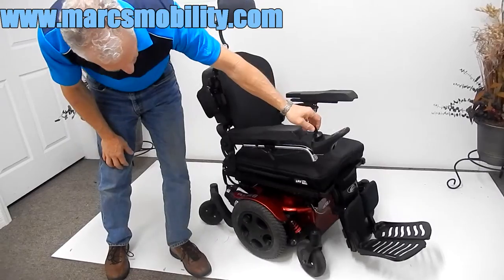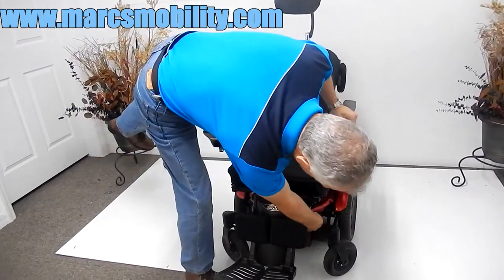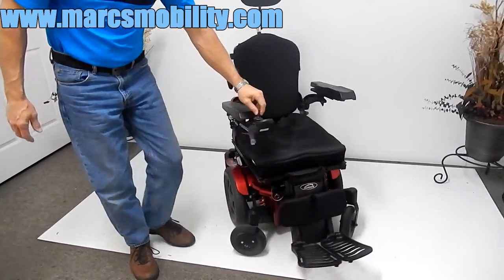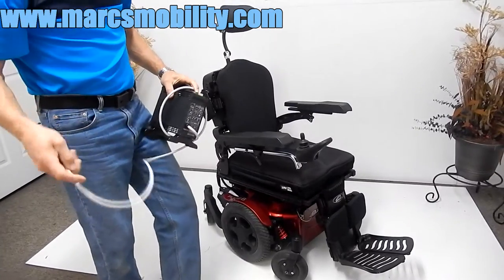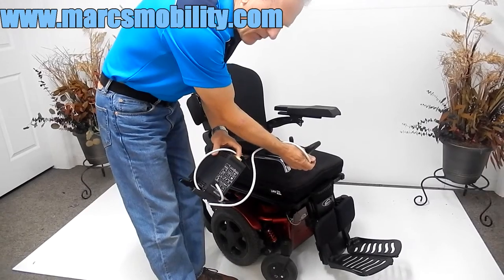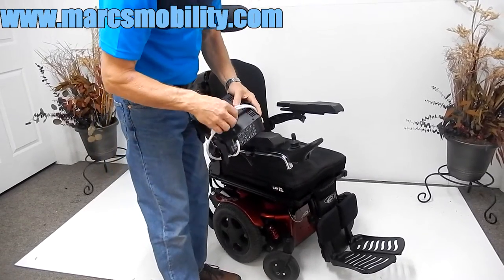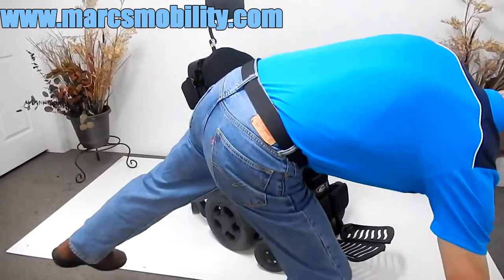The batteries in this chair come out from the front — you would have to tilt the seat up, pull the pins off the front, and slide the batteries in from the front. When you charge this chair, take your charger, plug it into the wall, and put the connector into the bottom of your joystick. When the light on your charger turns green, you're fully charged. Like most chairs these days, once the charger recognizes the batteries are full, it will automatically stop charging, so you're not going to overcharge the chair.